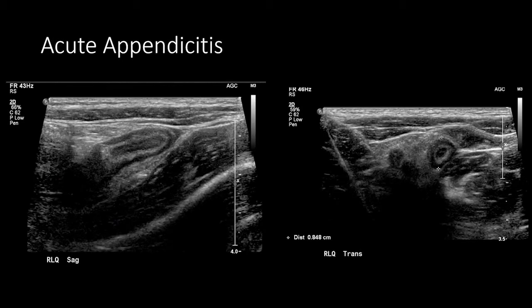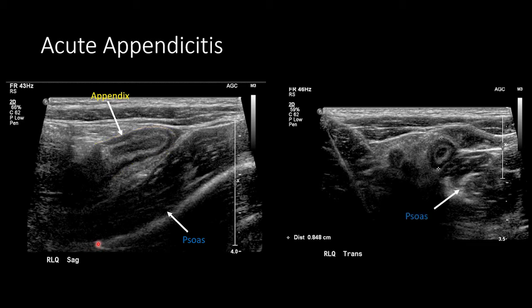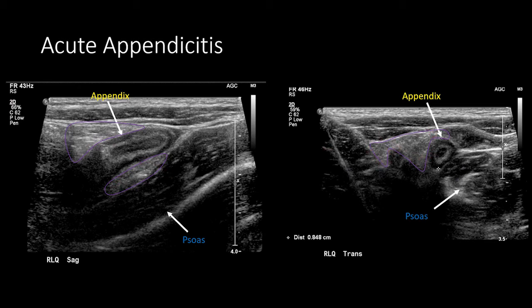Now let's look at a case of acute appendicitis. This appendix is oriented slightly differently, so we start with a sagittal image. We can again see the psoas in long axis, and overlying the psoas we see the appendix, outlined in yellow. Notice this appendix is much larger than the last one. On the transverse image with calipers, we can see the appendix is measuring greater than 8 millimeters — that is abnormal. Based on size criteria, the normal appendix should be less than 6 millimeters; 6 to 8 millimeters is equivocal; and greater than 8 millimeters is abnormal. In addition to the dilated appendix, we can see fluid within the lumen, thickened wall, and areas of echogenic fat outlined in purple, representing fat stranding or inflammation within the fat around the acutely inflamed appendix.